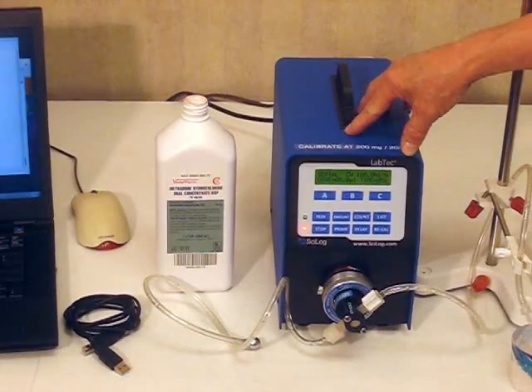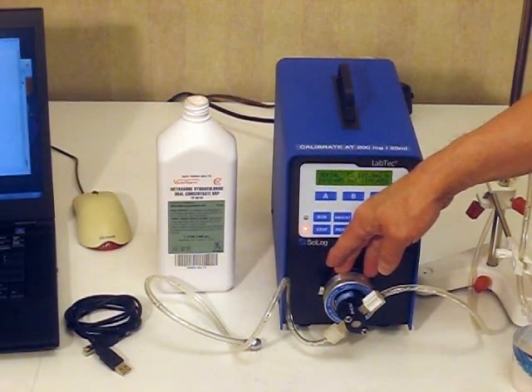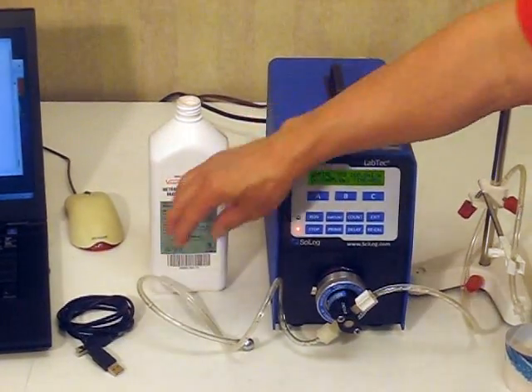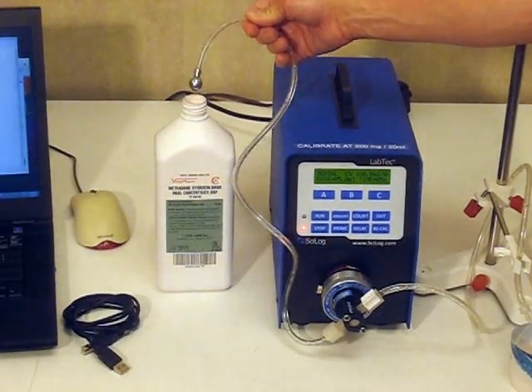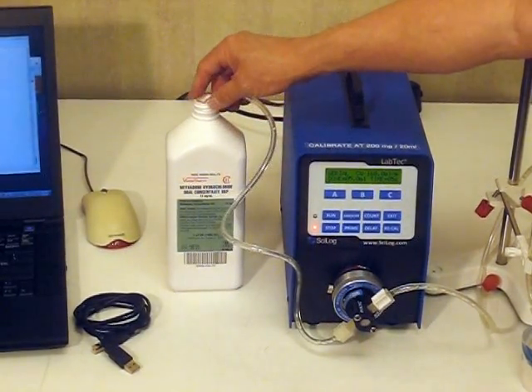It then converts it into telling the pump exactly how much to dispense based upon your input. Then the tubing is in our Methadone bottle. It has a sinker in the end of it. The sinker keeps the tubing at the bottom of the Methadone bottle.